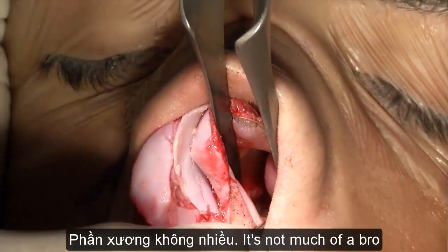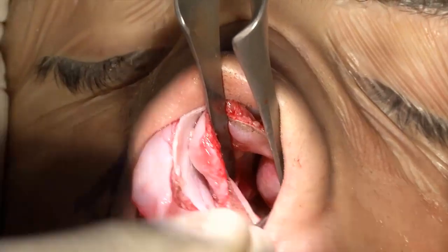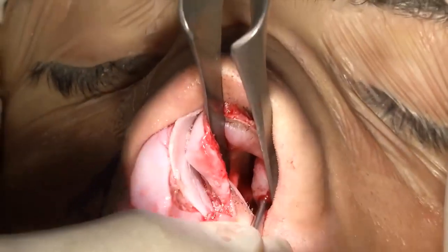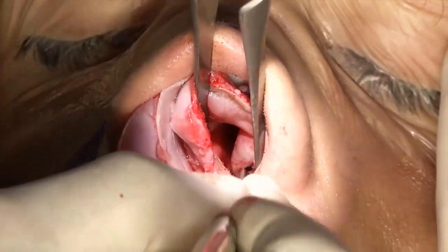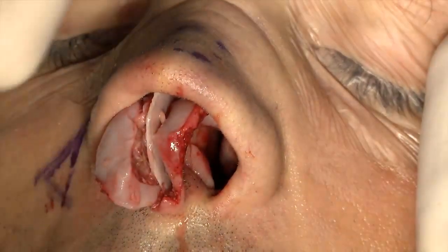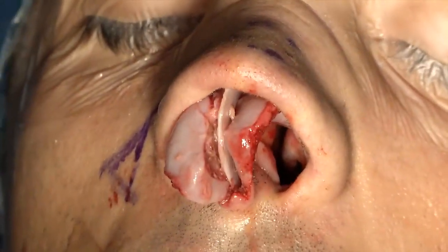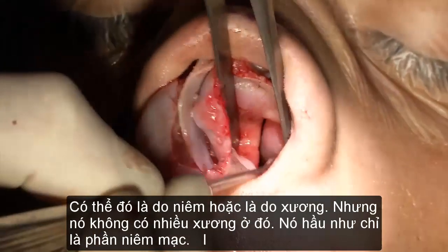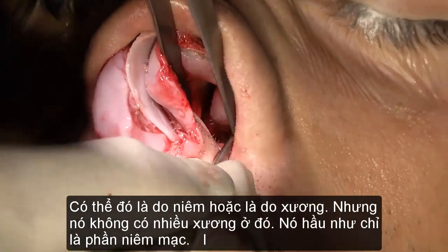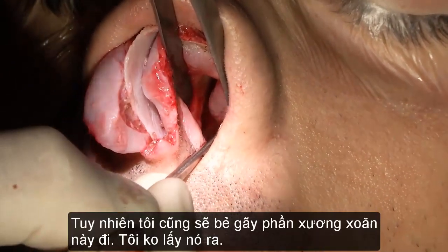It's not much of a bone. Is it mucosal or bony? Is there bone at all? Well, there's not much bone. It's mainly mucosal, actually, yes. Anyway, there it is. I fractured the bone. I'm not going to take it out.